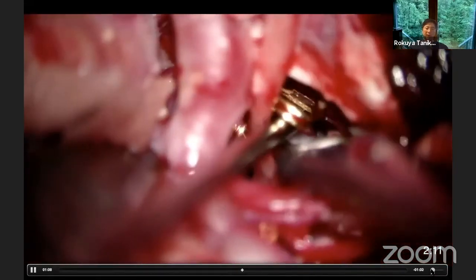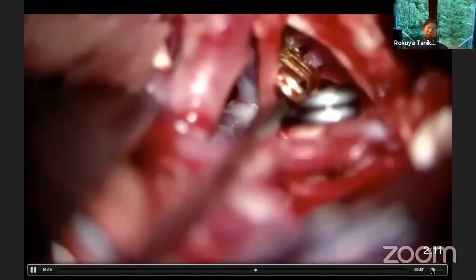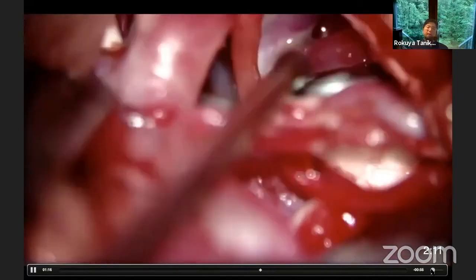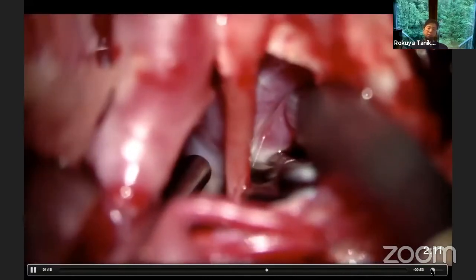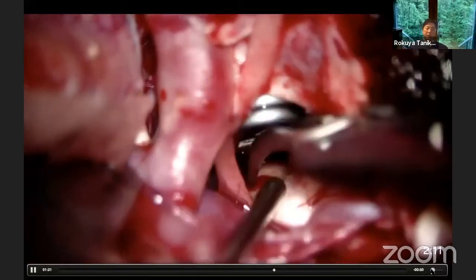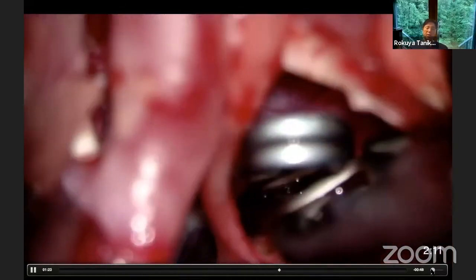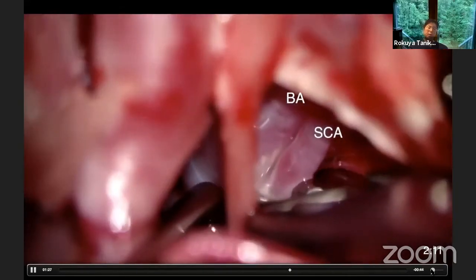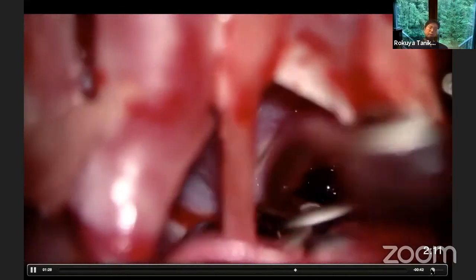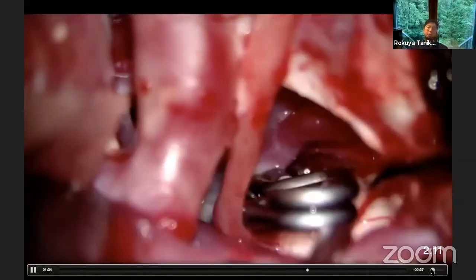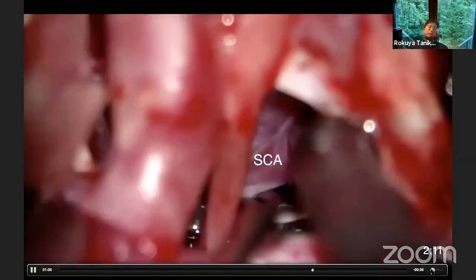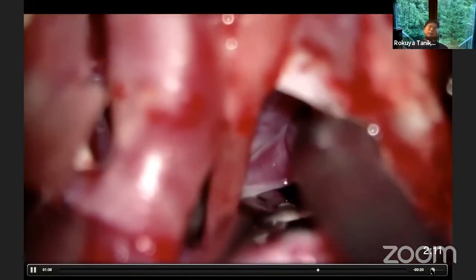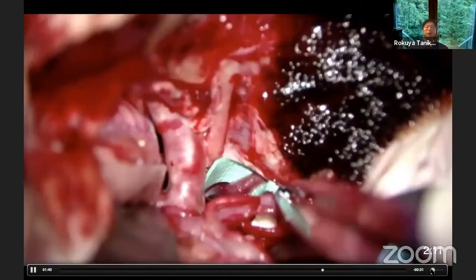I could make the space to put the clip at the neck. After detaching and removing the temporary clip, the superior cerebellar artery was occluded by the first clip on the neck. So I put the second clip distal to the first clip, and then I could restore patency of the superior cerebellar artery. Unfortunately, the Doppler signal of the superior cerebellar artery was a bit weak before neck clipping.